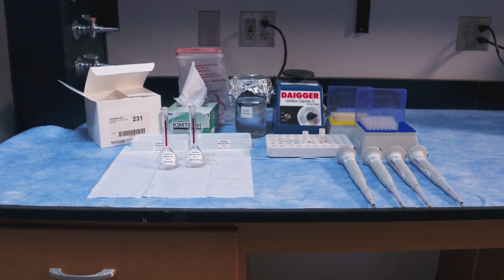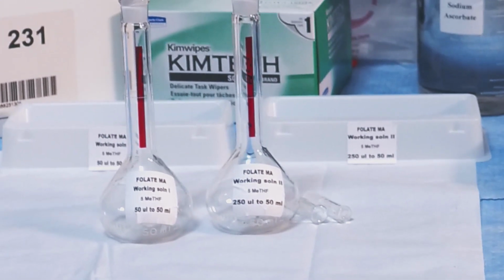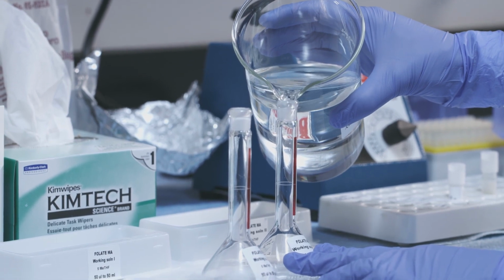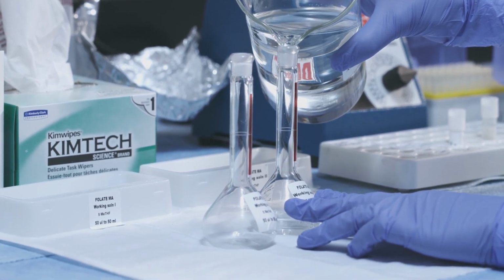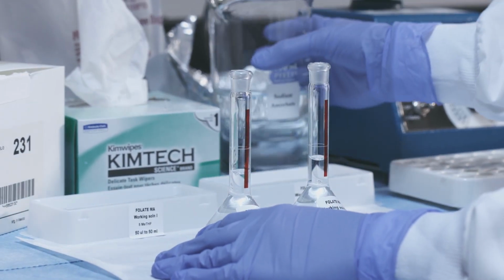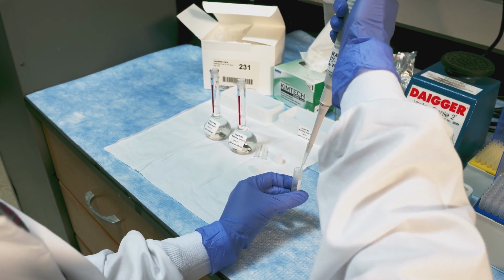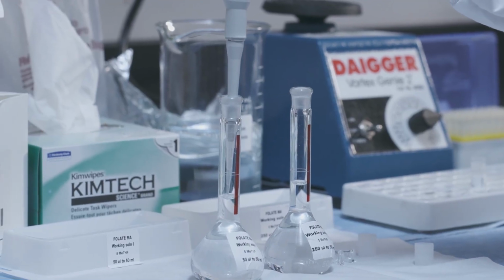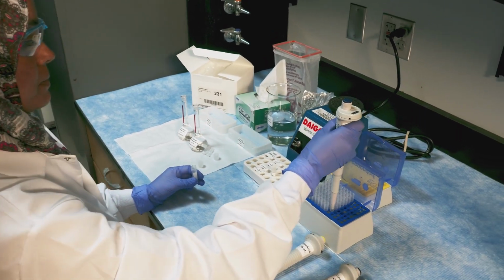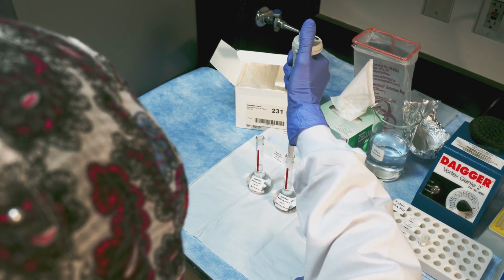Label 2 50 milliliter grade A volumetric flasks as level 1 and level 2. Add approximately 45 milliliters of sodium ascorbate to each flask. Transfer 50 microliters of diluted stock solution to the level 1 flask, and 250 microliters of diluted stock solution to the level 2 flask.